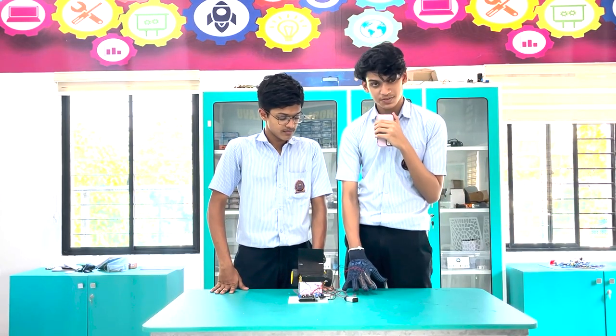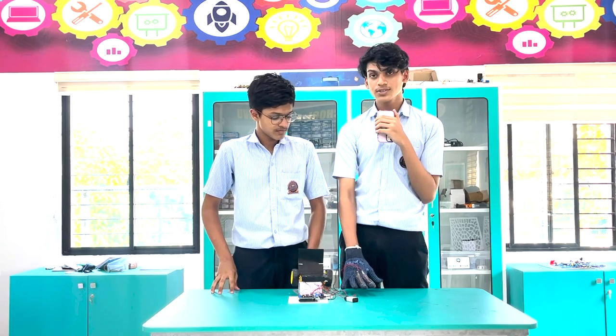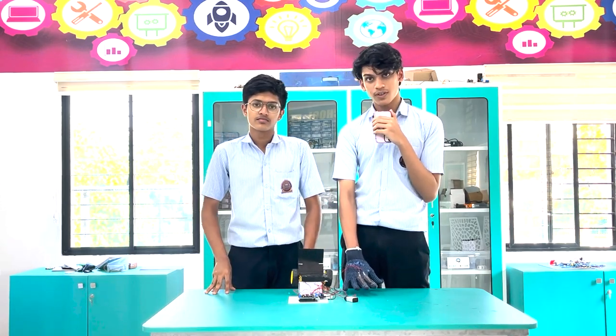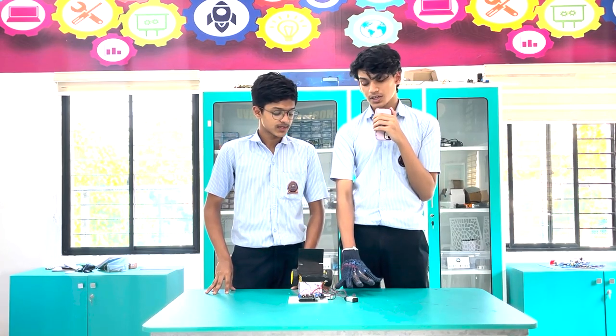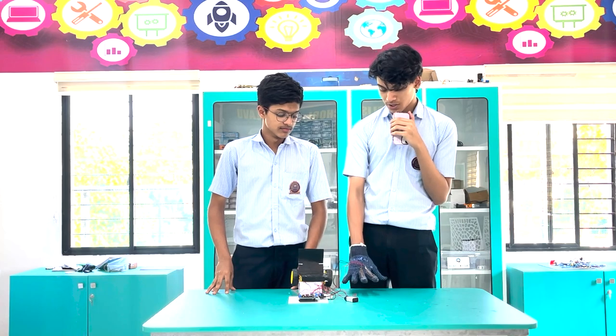The flex sensor is the main component in our project. We've connected two flex sensors onto a glove that the person using the wheelchair can wear. By bending each finger, a certain action is performed.